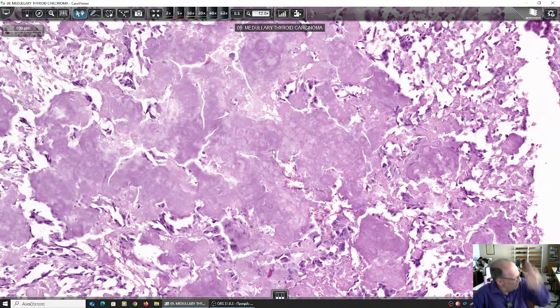And this specific amyloid has a homology in its amino acids to the molecules of calcitonin, because the cells that produce calcitonin are the cells making the amyloid. The term is medullary carcinoma of the thyroid. I think I got it wrong. Medullary carcinoma, not myeloid, medullary carcinoma. All right? I'm sure you've heard that in the theory lesson. Okay?